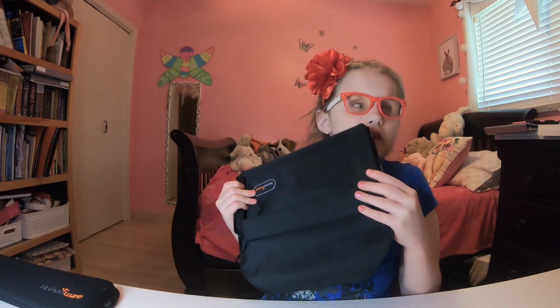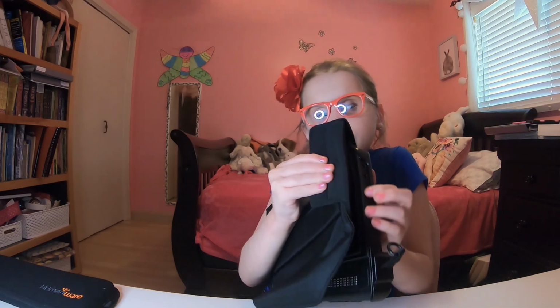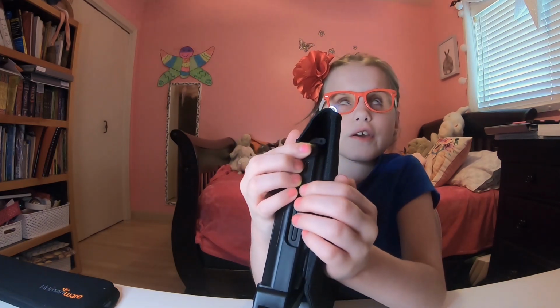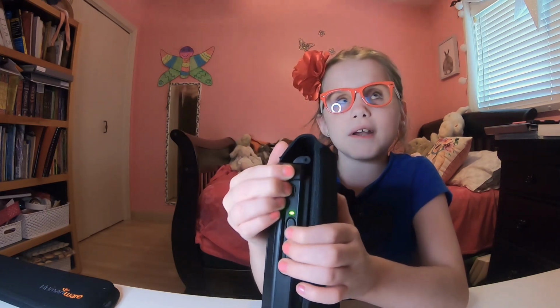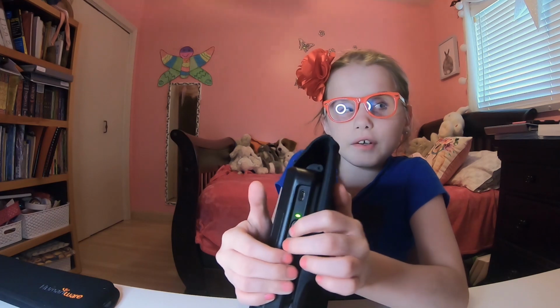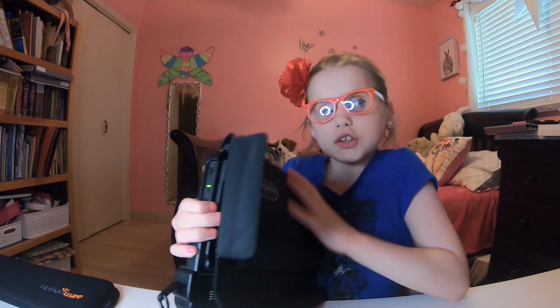And you've got your, hold on, let me just flip over the case again so I can show you guys, because this requires me to kind of flip up the flaps. So you've got your little volume controls on one side. I'm just going to show you guys. You've got your volume controls on one side and the oval little button. Again, in the introduction to BrailleNote Touch, oval button: power on and off, also lock and unlock. You have your volume up, volume down buttons.